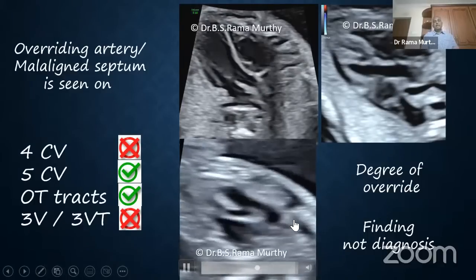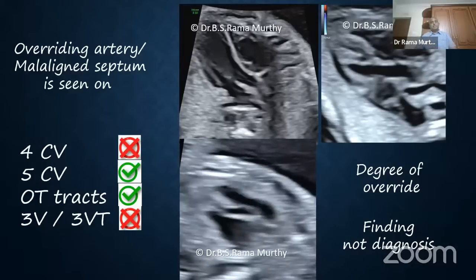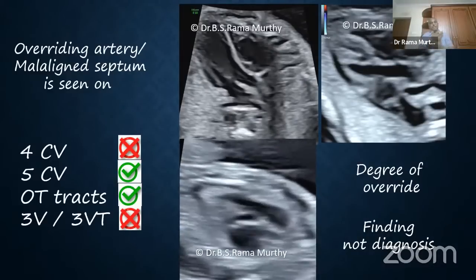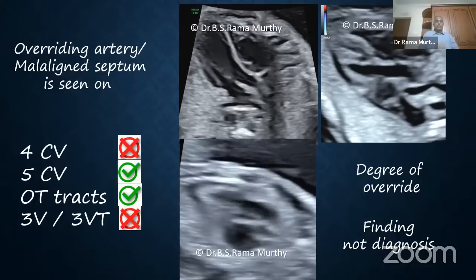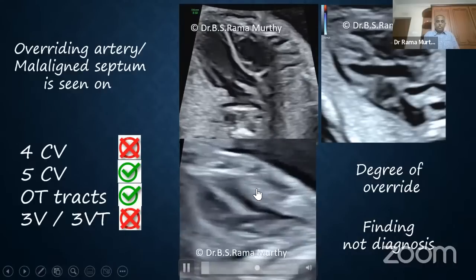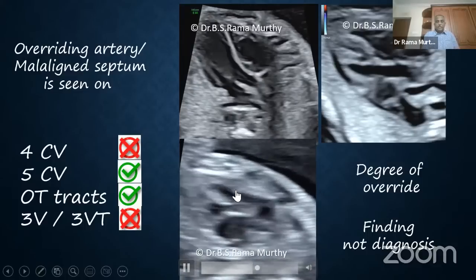So in my report, I cannot say I have seen an overriding artery and full stop. That is not a diagnosis. It is a step to diagnosis. It is a part of the other findings, which when taken in totality will give you the diagnosis. And also, this is a good view to look at the degree of override. Here, if you look very carefully, the aorta is more partial to the right ventricle.